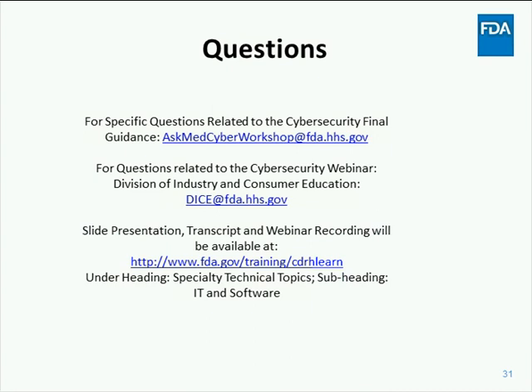Good questions. I'll address the second one first. That is ongoing work within the community right now in terms of adapting CVSS to be more medical device centric and really drilling down to what confidentiality, integrity, and availability requirements mean in terms of the medical device community.